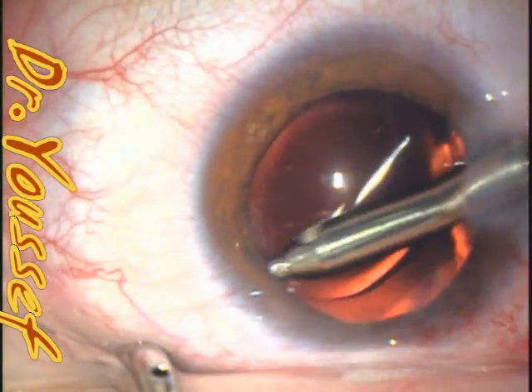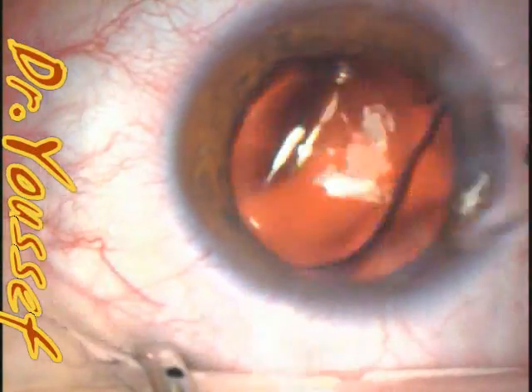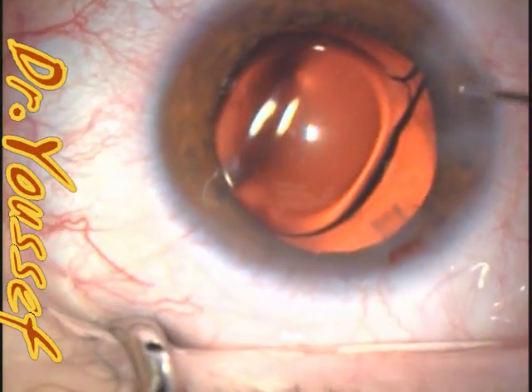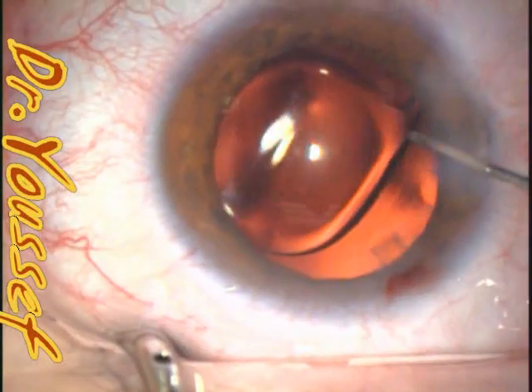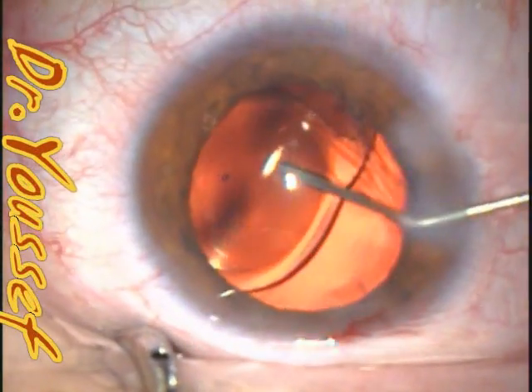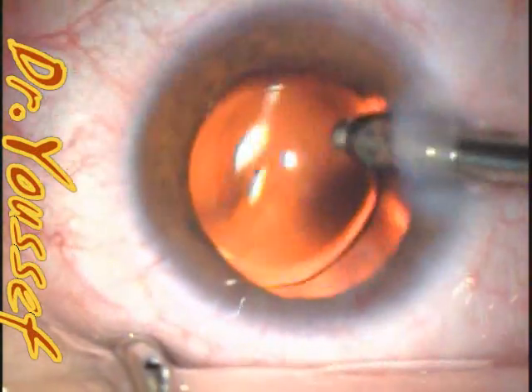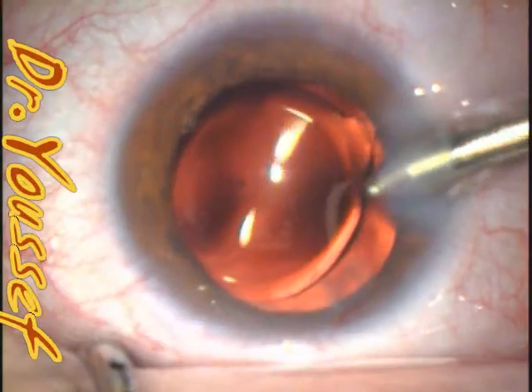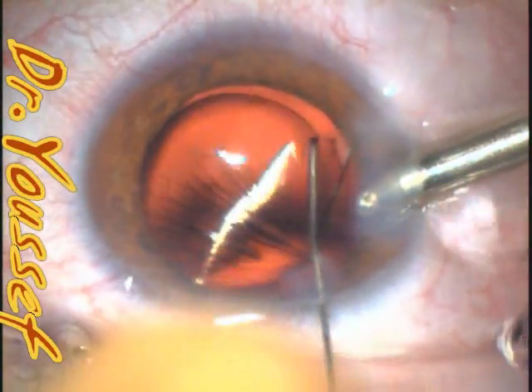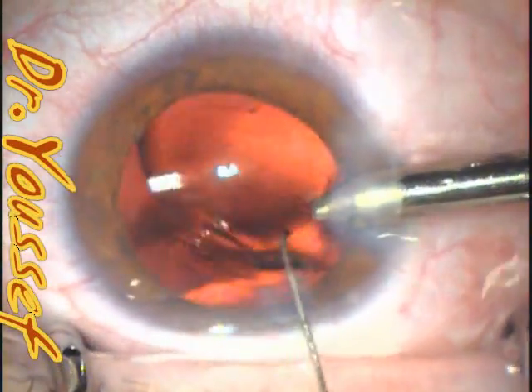Routine cortical cleanup and irrigation-aspiration while the lens is in the bag is much safer than doing it without the lens — we use the lens as a shield to protect the capsule. While doing the hydrodissection, I noticed this haptic was not in a good position. I checked it out, confirmed it was malpositioned, then went in with the IA as a chamber maintainer and used the Sinskey hook to pull it out of the sulcus and place it back into the bag.